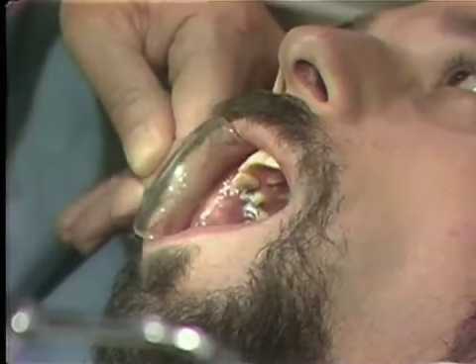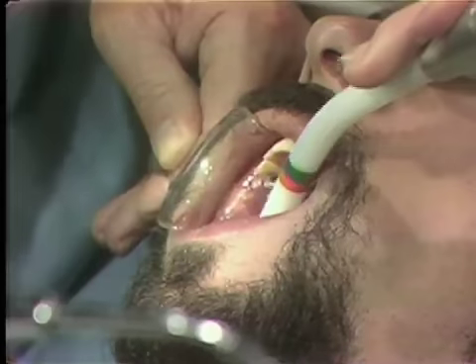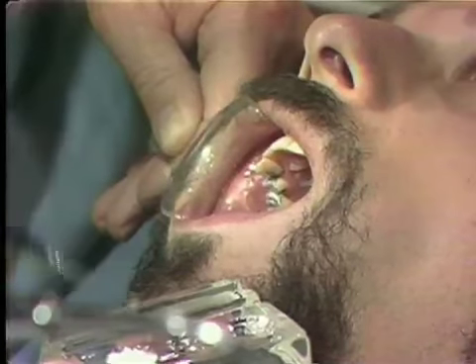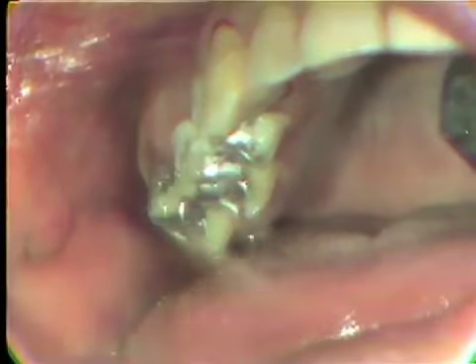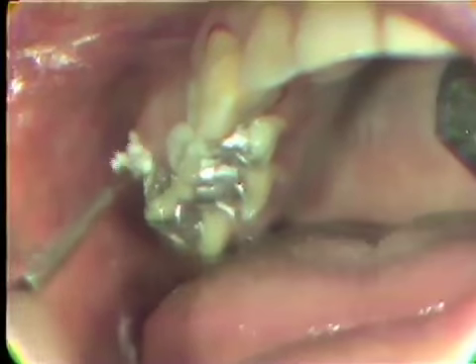Would you clean the mouth out there with the suction? Paint a thin layer of the Duralay around the cervical areas or the margin areas of the teeth. This will give you some real definite, accurate margins on the temporaries.